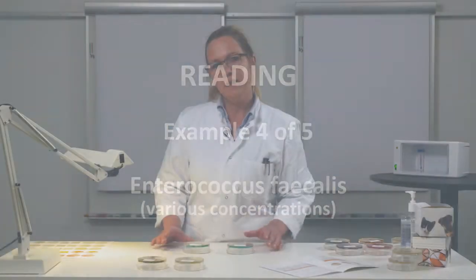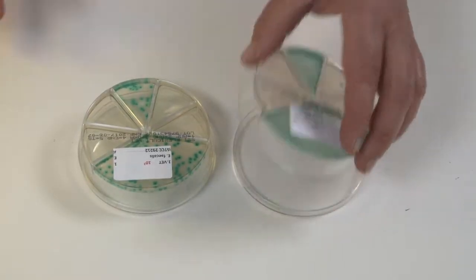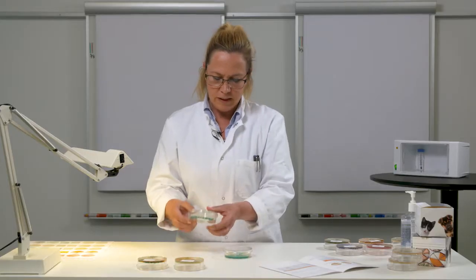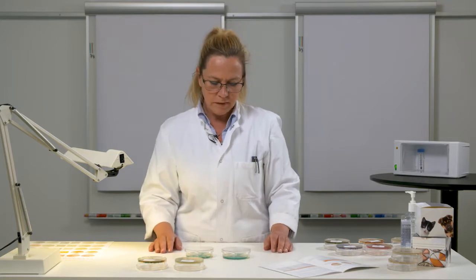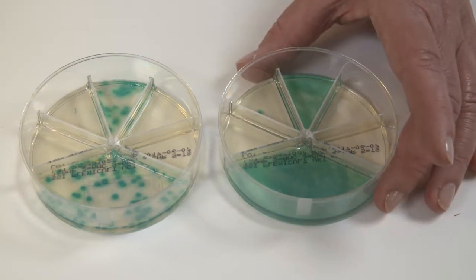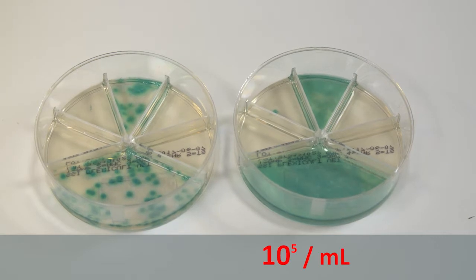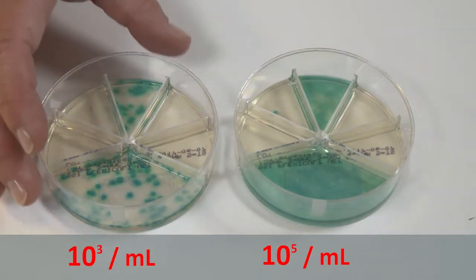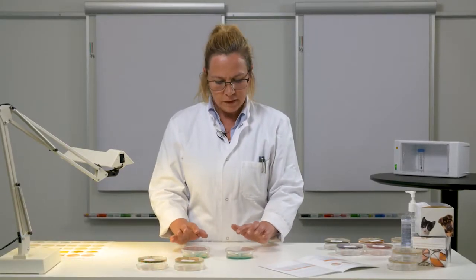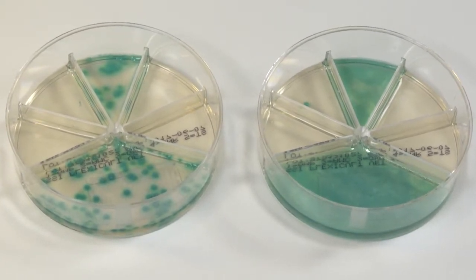I can also show an example where you can clearly see the difference in bacteria density. When I look at this plate, the colour tells me that it's an Enterococcus faecalis. But when comparing the bacteria growth on these 2 plates, you can tell that there is a higher bacteria density on one plate compared to the other. On this plate, density shows that there is 10 to the 5th per milliliter. And on the other plate, also with Enterococcus faecalis, density is only 10 to the 3rd per milliliter. Again, by reading the resistance compartments, you can find out which type of antibiotics to treat the bacteria with.